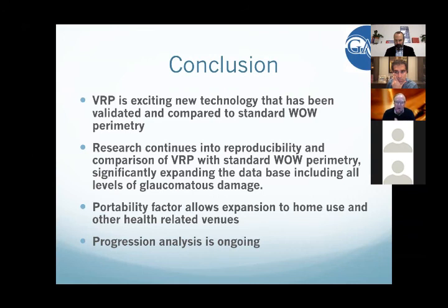The technicians learn all the little tricks with standard perimetry in the bowl, and they learn the little tricks associated with this. They can see it, and they teach the patient how to do it. It's quick, it's easy, and hopefully the patients will be able to do some of their testing at home, and we'll be able to look at it and monitor a physiologic function of the body just like the cardiologists do. So this is all very exciting to us.